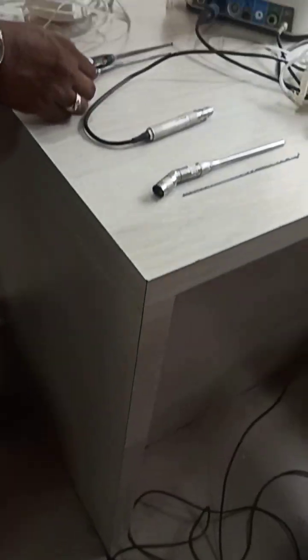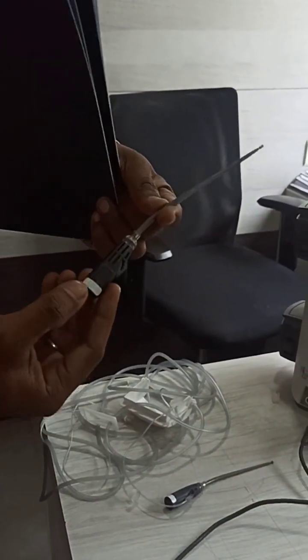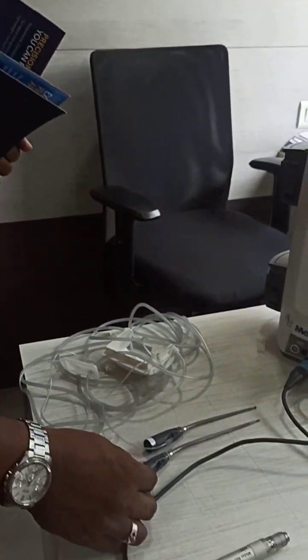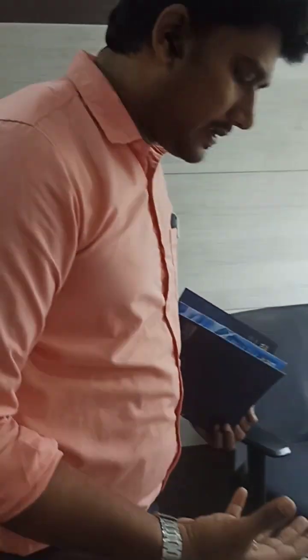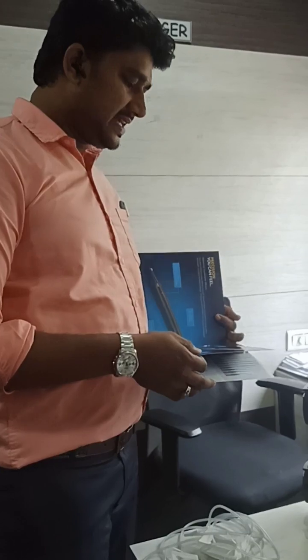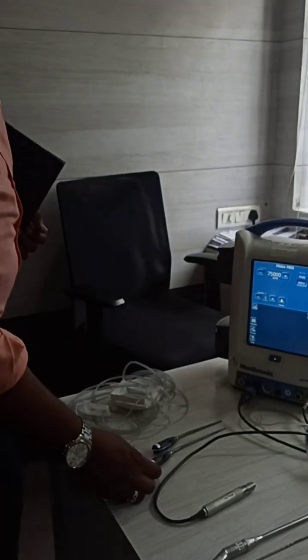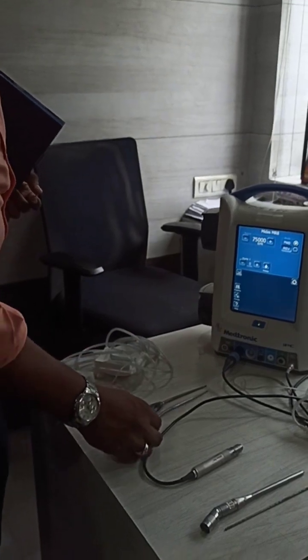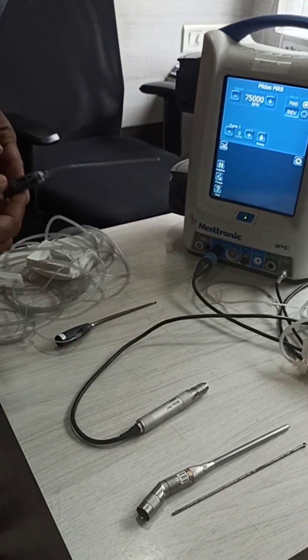Here you can see another special tool - this is the clear view burr. It is mainly used for skull base surgery like lateral skull base or cervical approaches in the spine, or in MIS procedures. All these procedures we can use this special tool, which is very helpful.